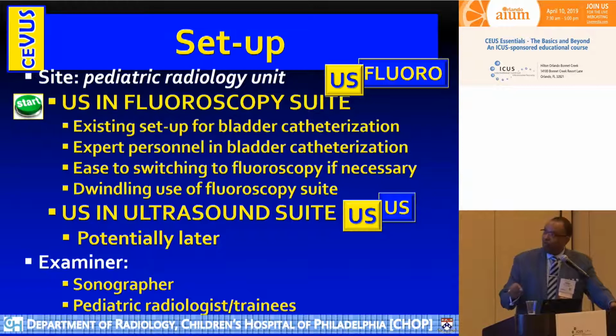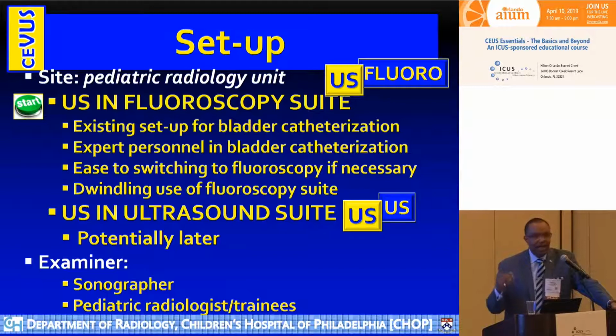But more important than the setup is that it's very important to have the sonographers as the frontline examiners. Only that way will you be able to establish the examination properly in your department. It is not the way we do it here. It is not led by doctors in the forefront. It's led by sonographers. So it's important to train the sonographers. And I can stand here and say that I am extremely proud that we have some 20 sonographers and everyone does this reflux study alone. I just found out when I rotated, I said, oh, I'm doing it alone, and they said, oh, you can just come in when I'm ready. I was quite impressed. That's how they do it, and 20 of them do all the ultrasound reflux examinations.